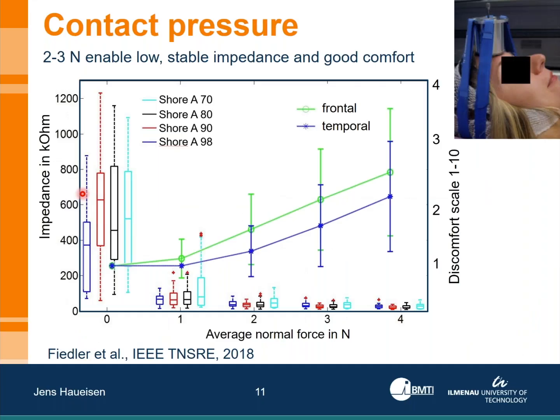Now, one thing we observed in this very first study was that contact pressure is an issue with the dry electrodes. That means if you have electrodes which are sort of loose on your head, so they're not really pressing on the surface with some force of whatever kind, then the recording is typically not at all usable, or at least quite noisy. And that means we have to look into contact pressure.